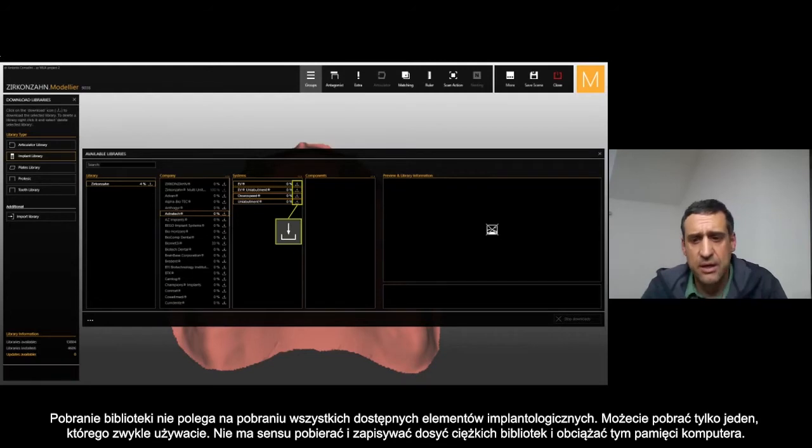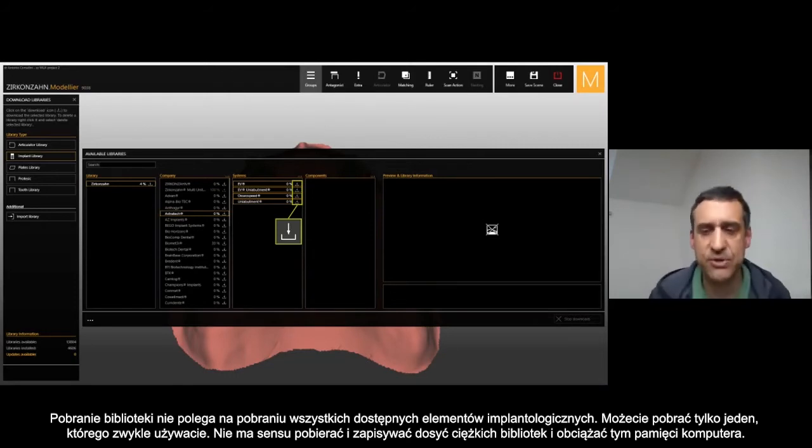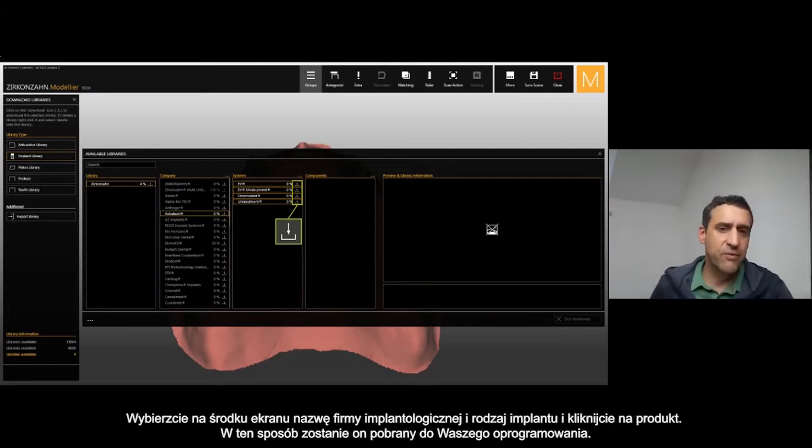Downloading the libraries means you don't download all the implant components from every company, but just the ones you are using. It makes no sense to download the complete library because it's a really heavy library.